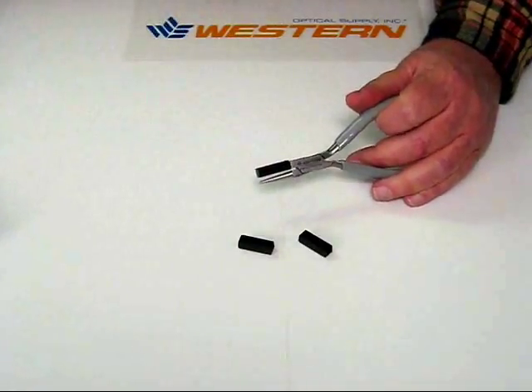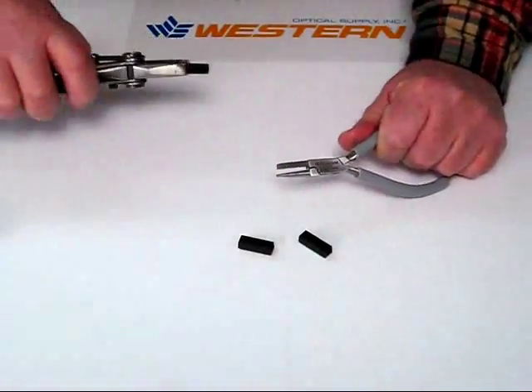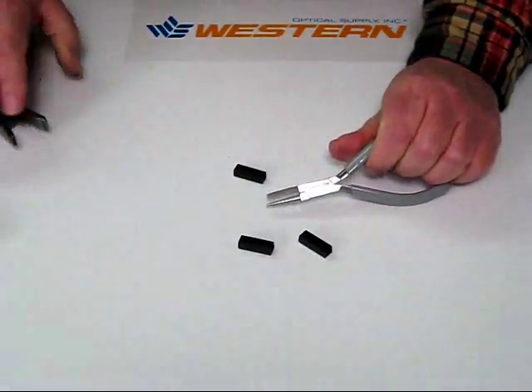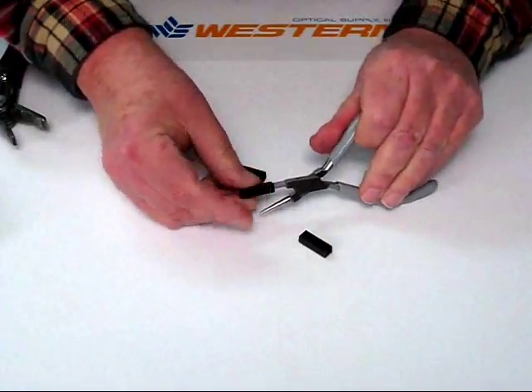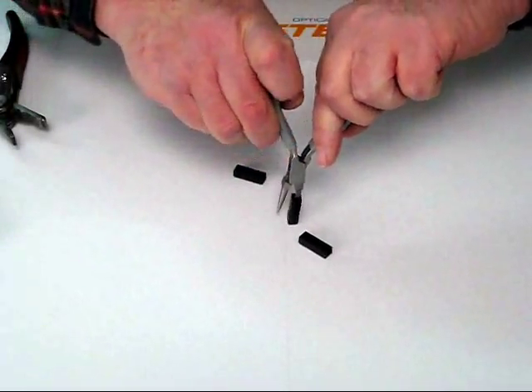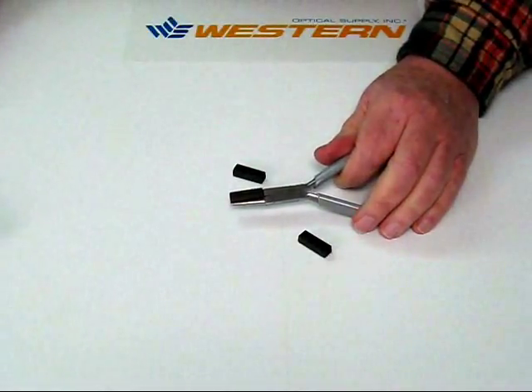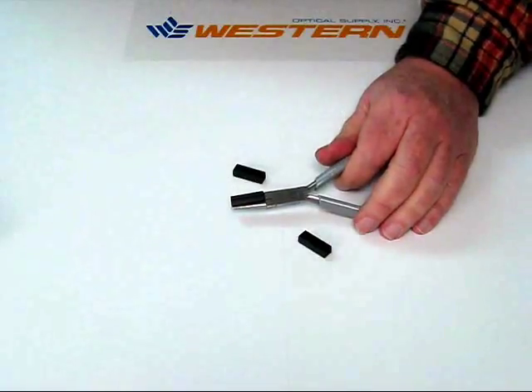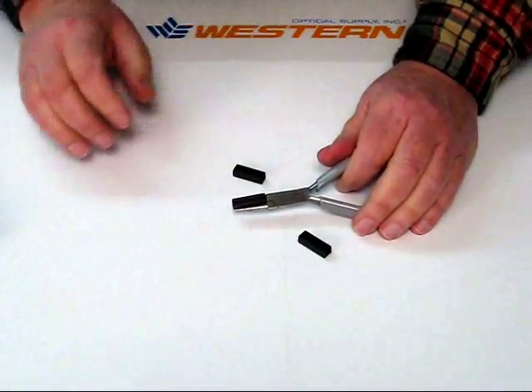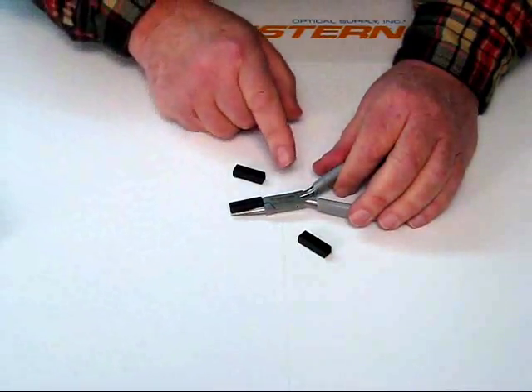So to replace a pad is easy. You just grab it, pull it off, take a new pad, line it up, push it into place, and it's done. Now, if any of you have replaced a pad on another plier, you'll know that that was a fraction of the time and zero frustration in replacing a Western Optical pad.